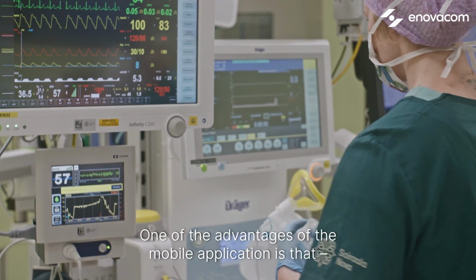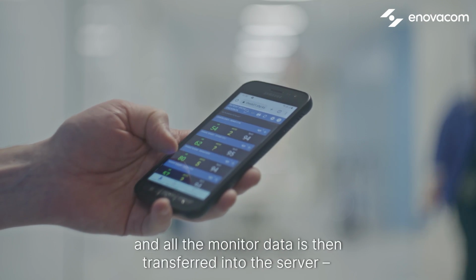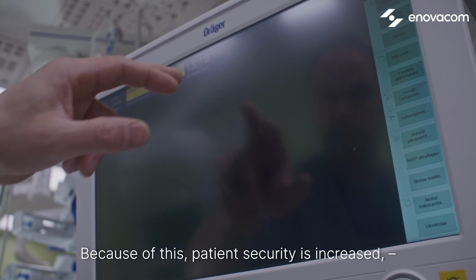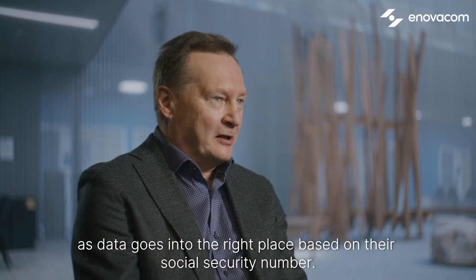One of the advantages of the mobile application is that it associates the patient identifier and the device, and all the monitor data is then transferred into the server based on the patient identifier. Because of this, patient security is increased as data goes into the right place based on their social security number.